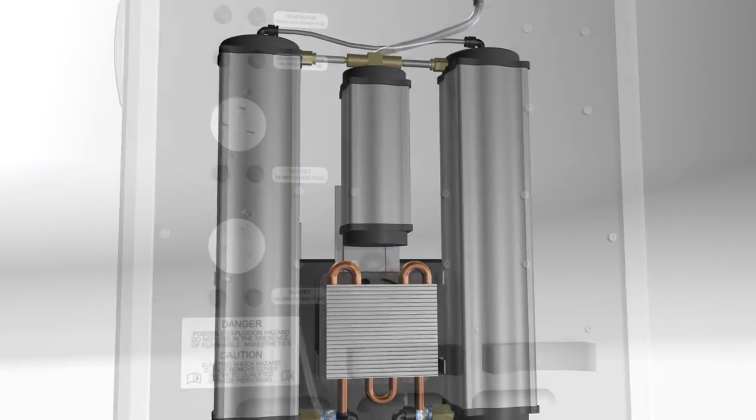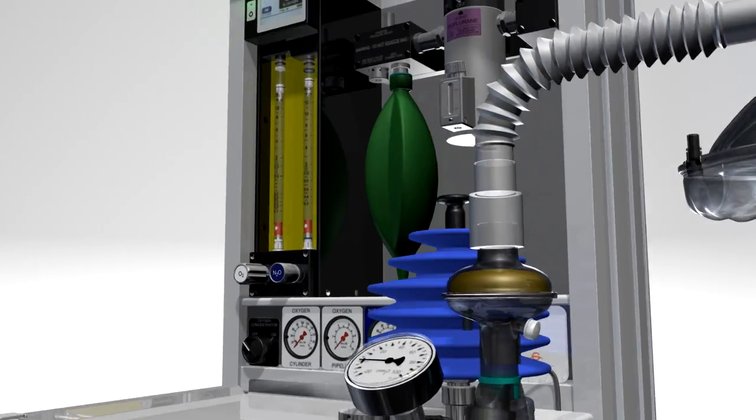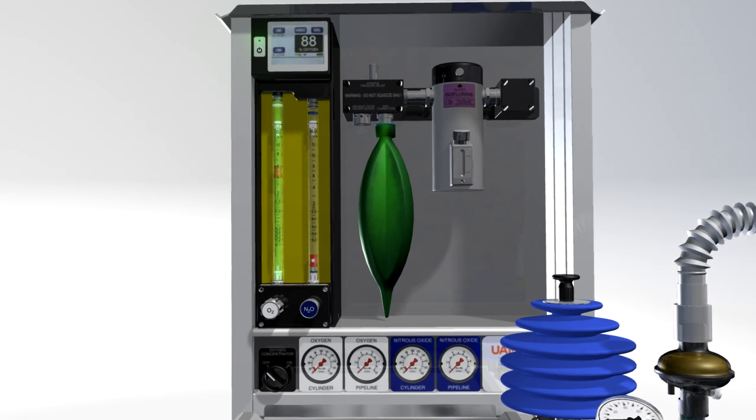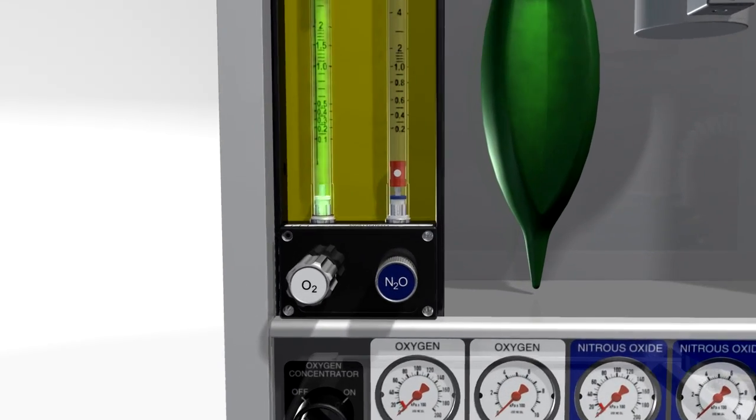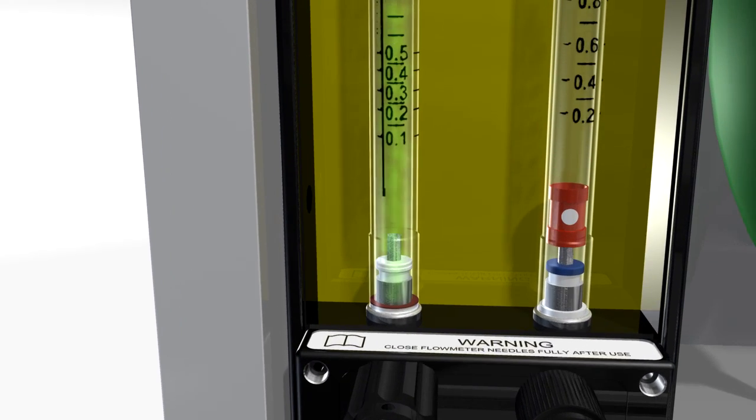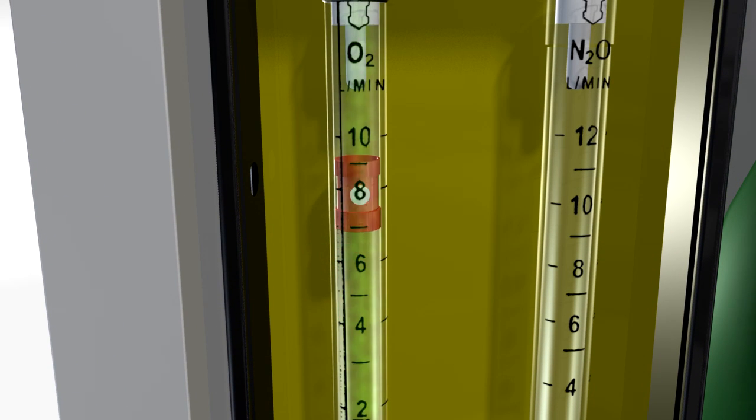The UAM produces up to 10 liters per minute of oxygen. The oxygen then travels through the flow meter into the back bar and reservoir bank. The flow meter controls the amount of oxygen entering the back bar and available for the patient. The spinning bobbin shows the flow rate in liters per minute.